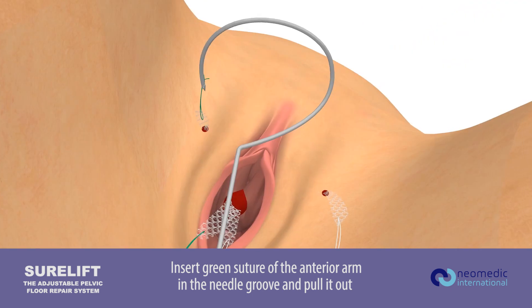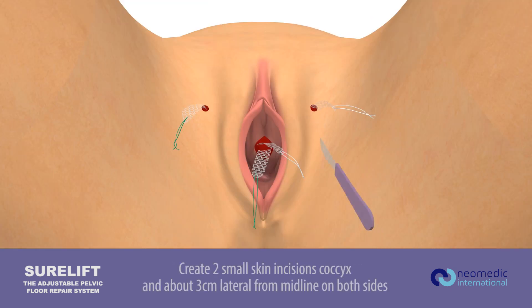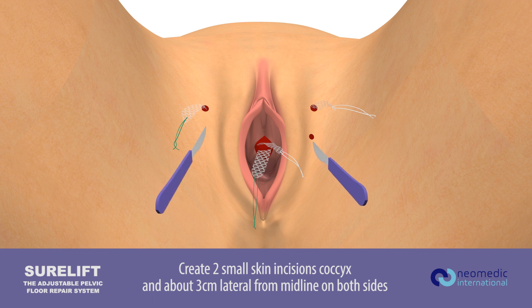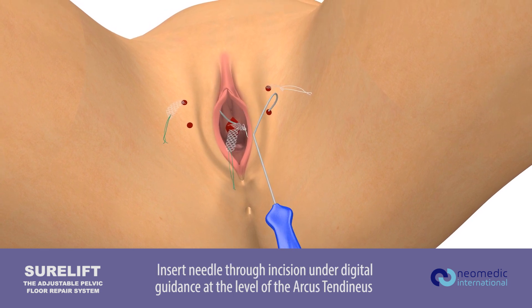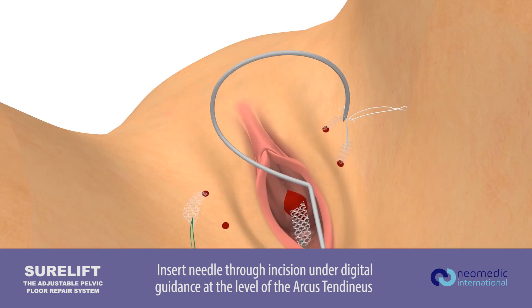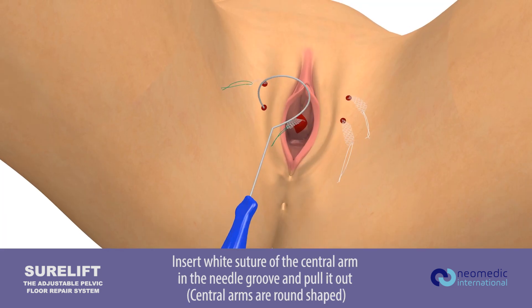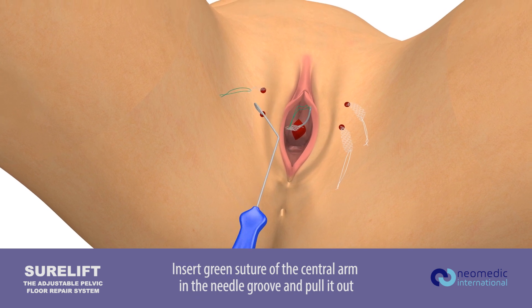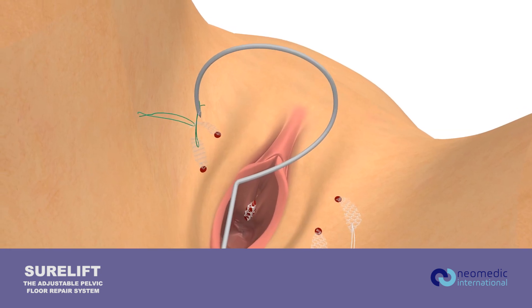Anterior arms are arrow-shaped. Create two small skin incisions at the coccyx and about three centimeters lateral from midline on both sides. Insert needle through incision under digital guidance at the level of the arcus tendineus. Insert the white suture of the central arm in the needle groove and pull it out. Insert the green suture of the central arm in the needle groove and pull it out. Central arms are rounded shaped.